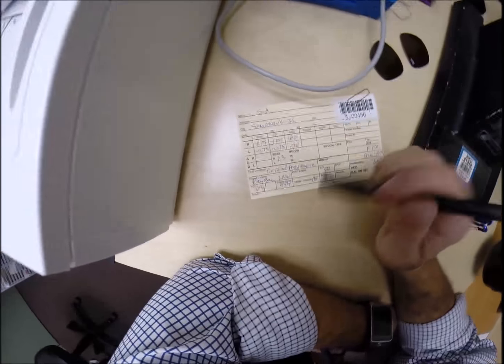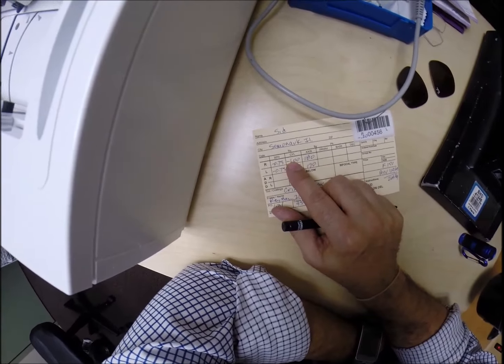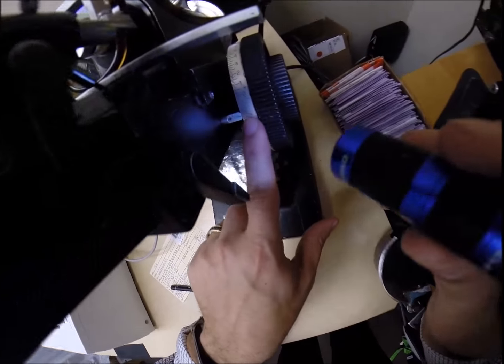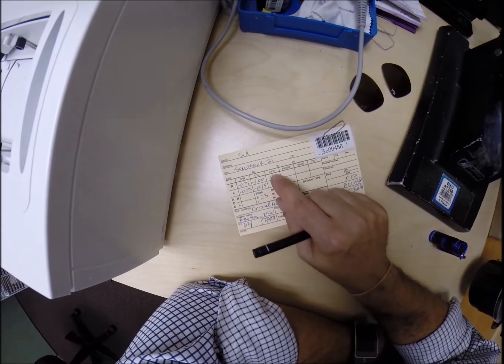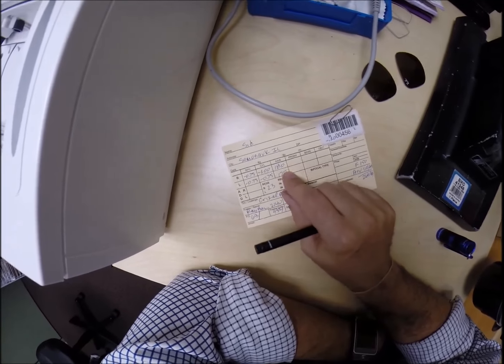That's because, remember high school algebra, you add 2 like signs together? Yeah, I've forgotten it too, don't worry. Let's use today's term. Someone borrowed 75 cents from you, then they borrowed another $1. They would be 175 in the red. They would owe you 175. That's where we're at, 175 in the red. Now, as I was saying, these first 2 numbers are real values to be concerned with. This last number could be anywhere from 0 to 180. And it's just an arbitrary number.